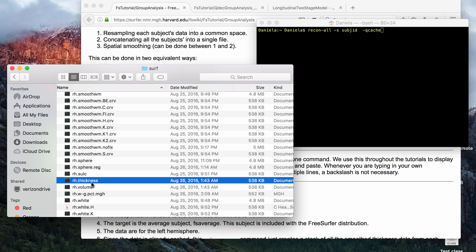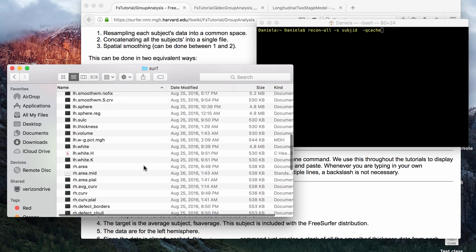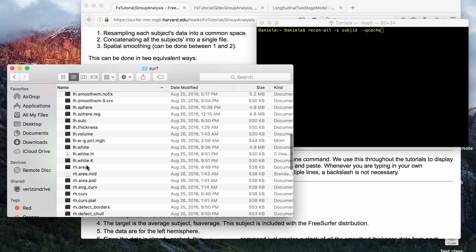For example, right hemisphere thickness, right hemisphere sulci, also right hemisphere area, these will all get smoothed to the various levels and they will also get mapped to FSAverage.